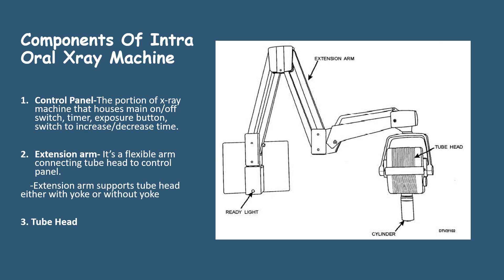The control panel is the portion of the x-ray machine that houses the main on and off switch, timer, exposure button, and a switch to increase or decrease time. This is the control panel.